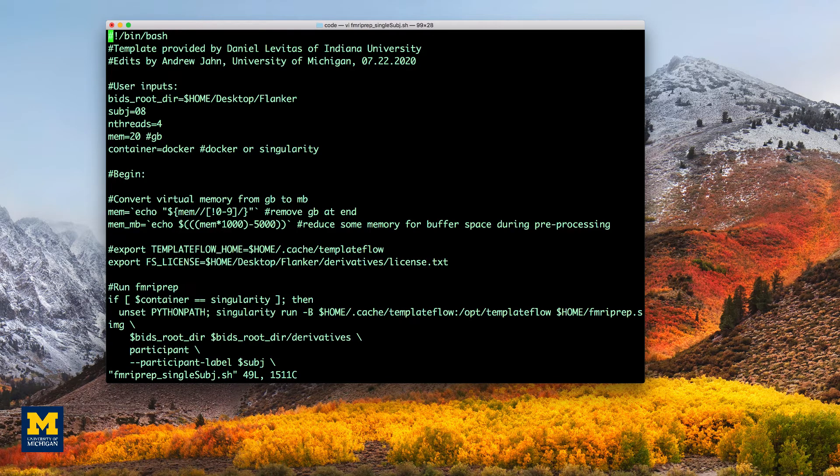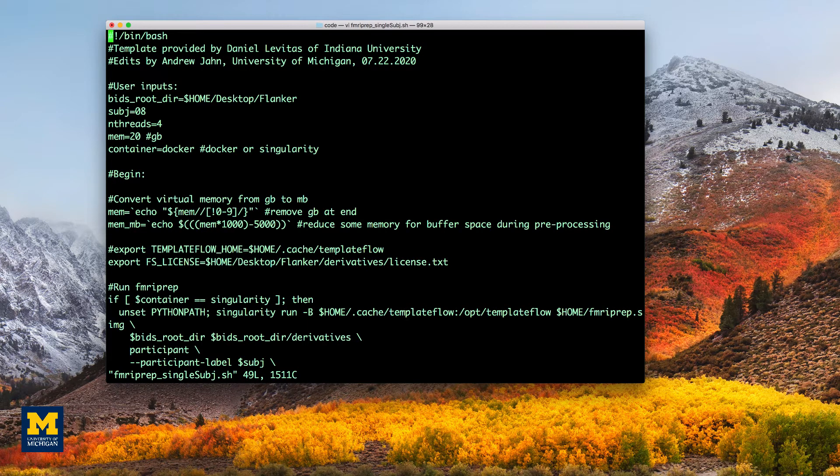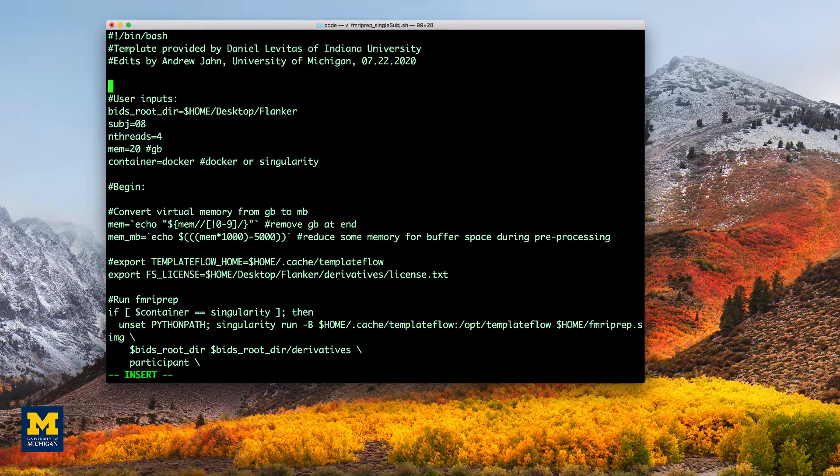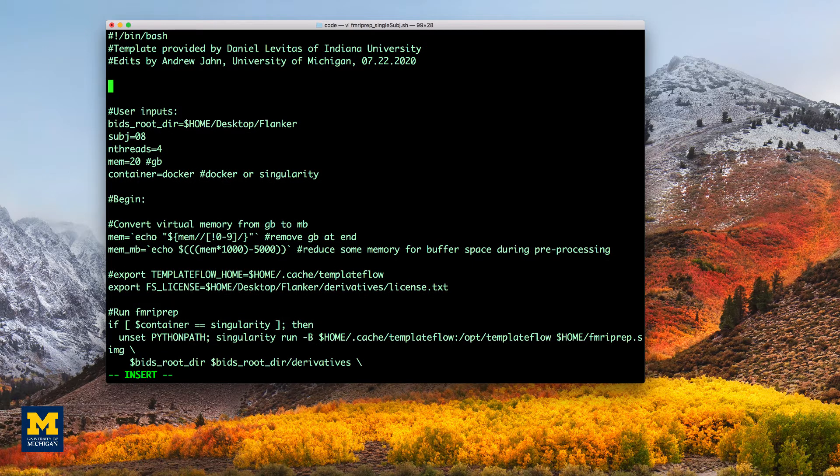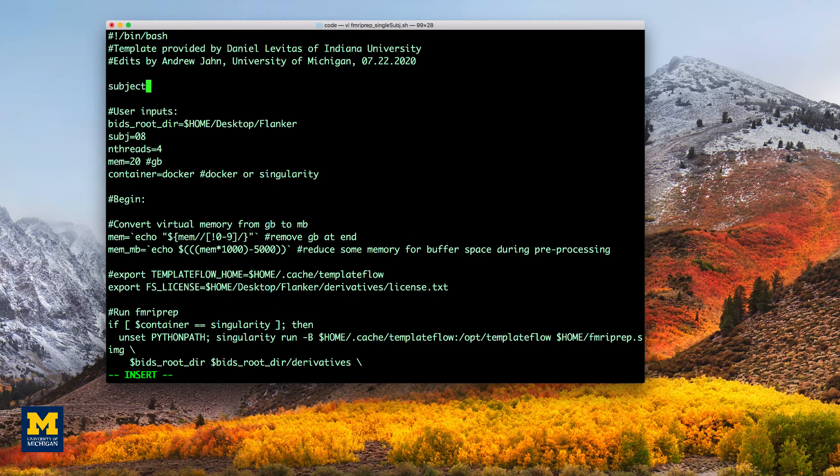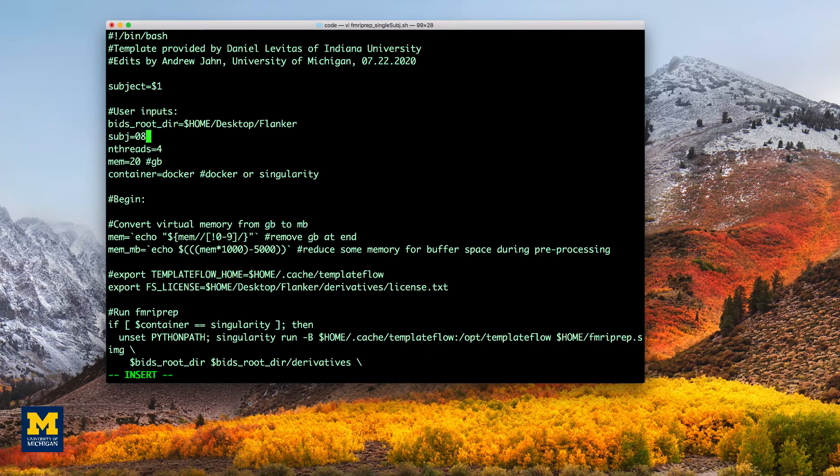I'm going to edit this in the VI editor. Right here, you can insert this line of code, subject equals $1, which is the first input that the user puts in. And then we replace await with $subject.